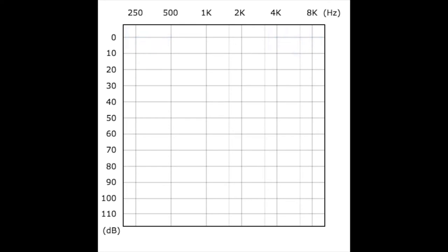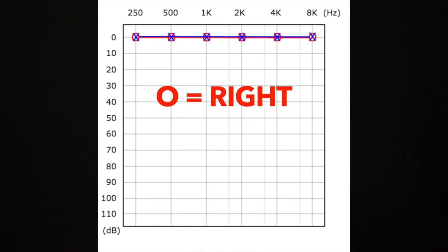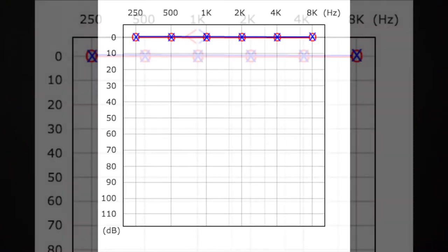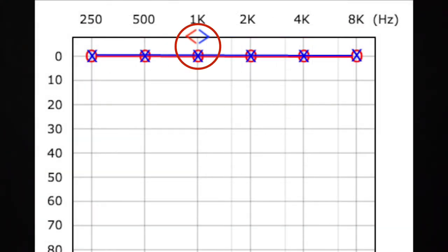A volume of 0 dB at the top is very soft, while 110 dB at the bottom is extremely loud like a jet engine. The red O indicates the right ear results, and the blue X indicates the left ear results. The O's and X's are your responses to the hearing test and indicate the softest level where you hear each sound, marking your hearing threshold levels for air conduction or regular headphones. You should also have a small red or blue bracket near or above the O's and X's, which indicates how well you hear the tones with bone conduction.